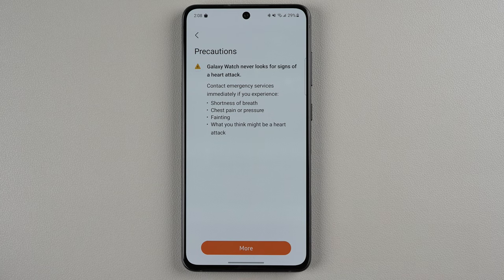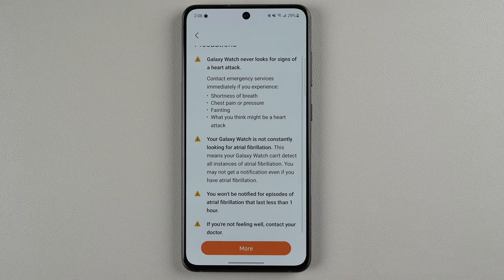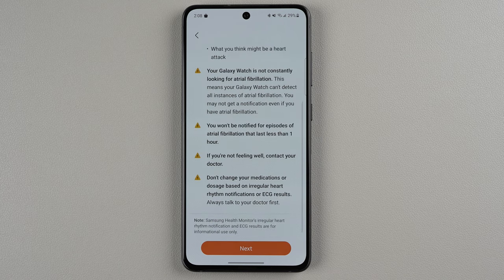And again with precautions — they just want to make sure you don't use this when you think you're having a heart attack. It is not constantly looking for AFib, which means your Galaxy Watch cannot detect all instances of atrial fibrillation, and you may not get a notification even if you have atrial fibrillation. You will not be notified for episodes of atrial fibrillation that last less than one hour. If you're not feeling well, contact your doctor. Don't change your medications based on these results. So now we can finally tap next.